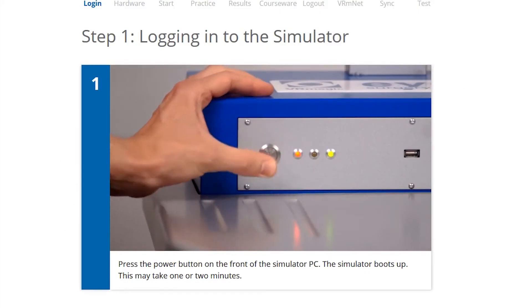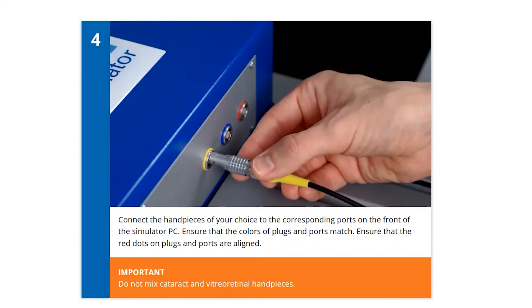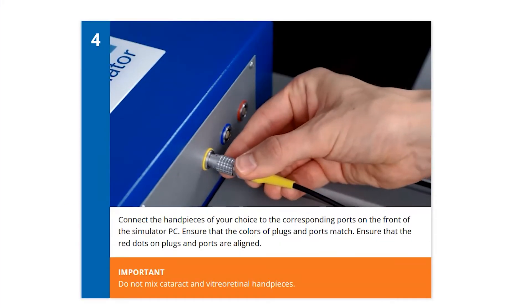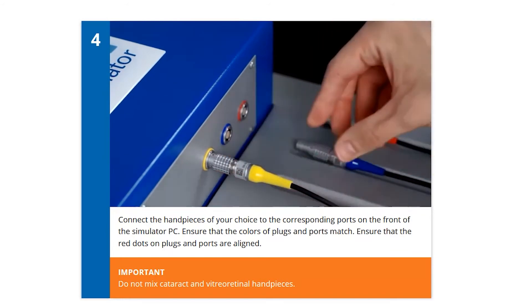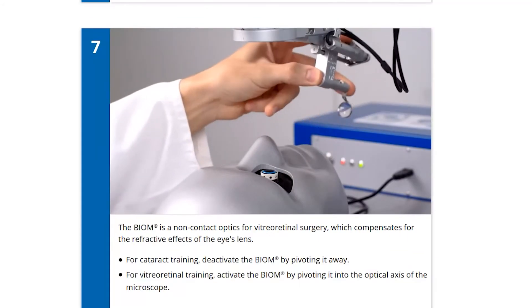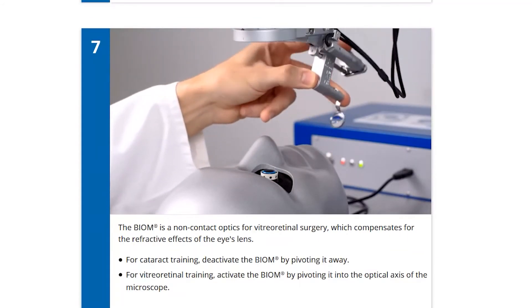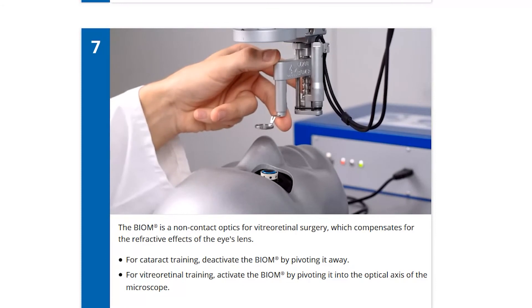An orientation course with step-by-step videos brings users up to speed quickly on correct and safe simulator usage before using the simulator for the first time.